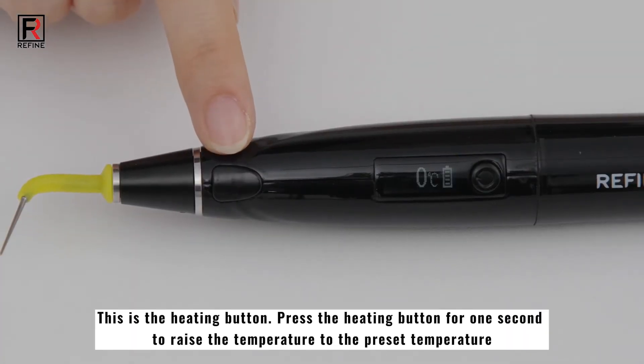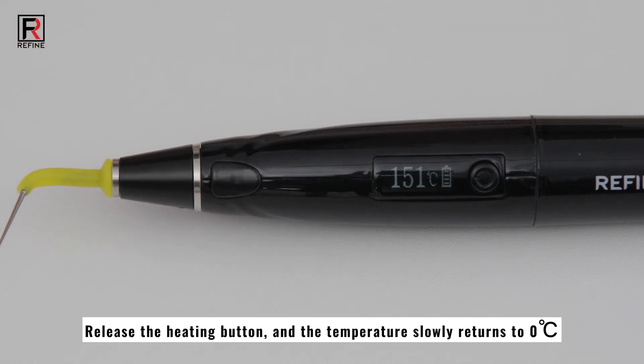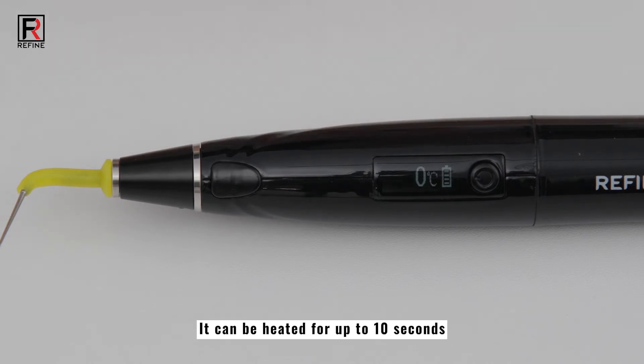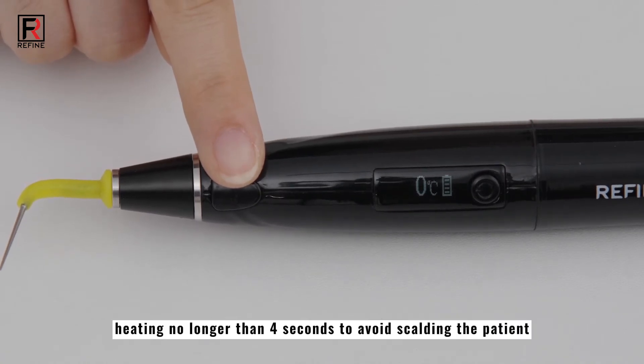This is the heating button. Press the heating button for 1 second to raise the temperature to the preset temperature. Release the heating button and the temperature slowly returns to 0 degrees Celsius. It can be heated for up to 10 seconds. It is recommended that heating be no longer than 4 seconds to avoid scalding the patient.